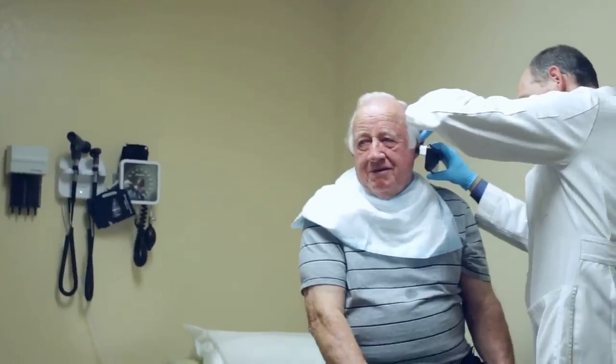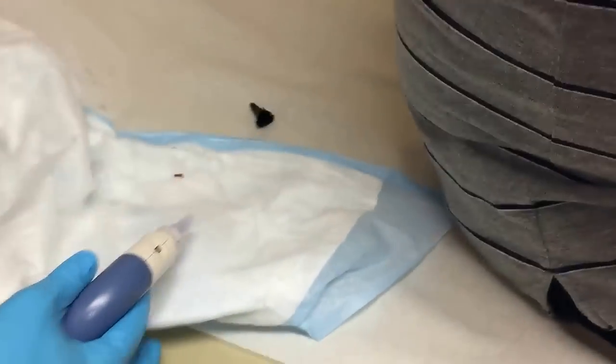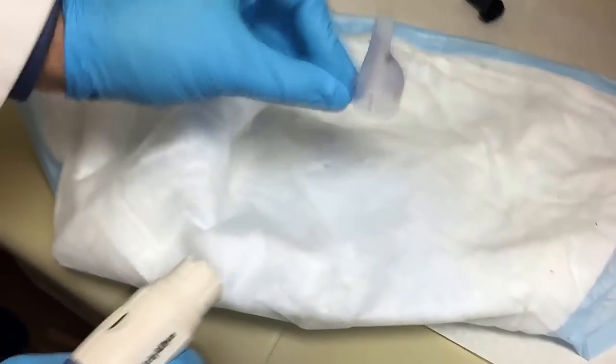Take a look with this — once you get past the wax you can see the eardrum is clear. But that little bit of wax hurts to move around. Do you want me to leave it in or take it out? Leave it in and I'll get it with a Q-tip. We'll call that good. Hopefully the rest of that wax will come out. I encourage you to continue to help this along by using earwax drops like Debrox or Murine earwax drops, because they're going to help. What about peroxide? We prefer that you dilute it with some water.